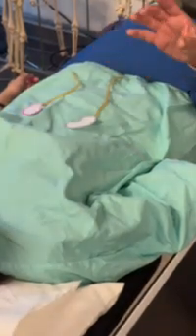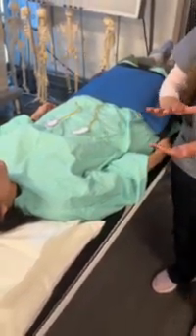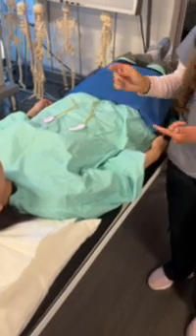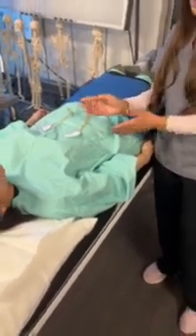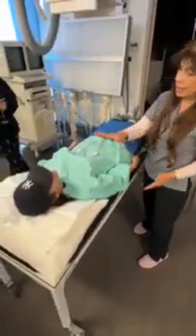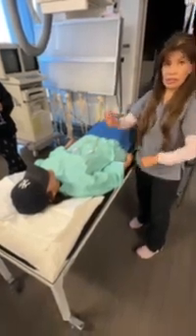There was one point where we did tomos, right in here. By then you had already measured your patient and divided the measurement into equal levels. And then you will do your tomograms at this point. You set it up on your control panel and the tube will move and slide the kidneys this way and give you images, every time you have to change, okay?